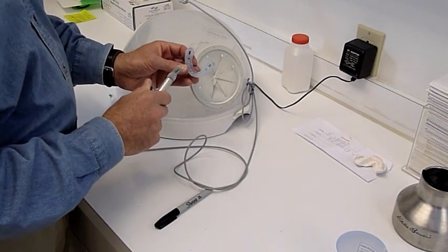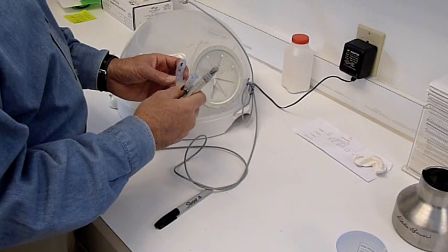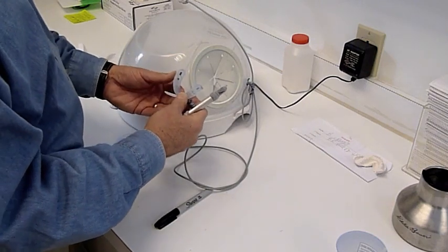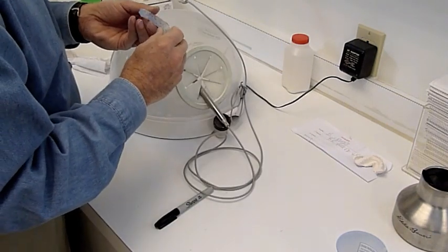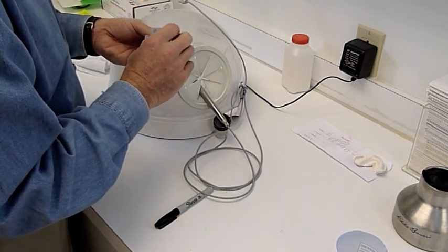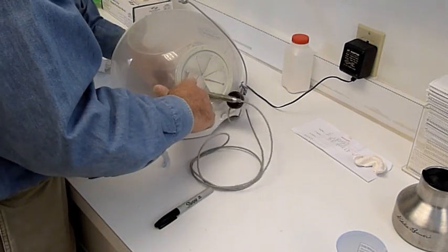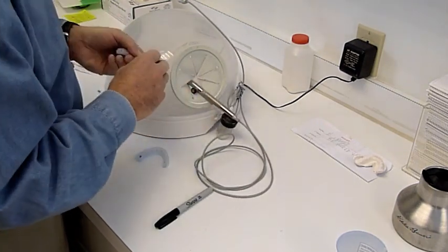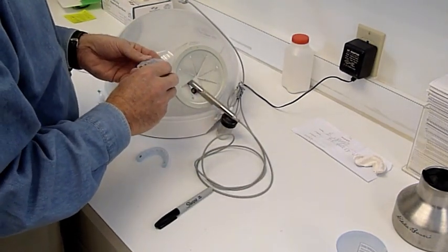If you go ahead and remove all the bonding material, you'll end up with a weakened bracket base. So check to make sure that pencil marks are removed. That's clear. That one is clear.